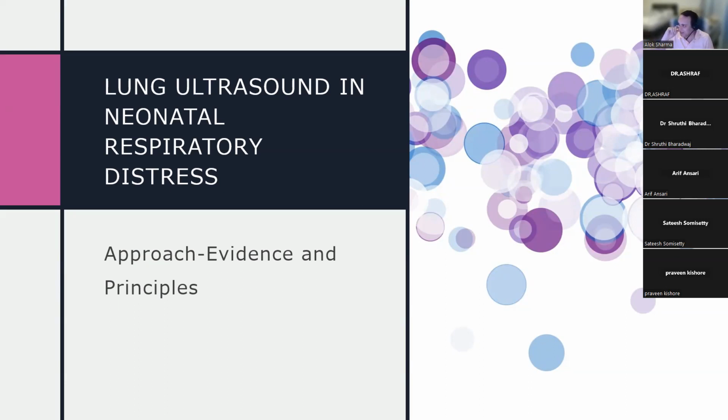And the question that I would always ask is, does that baby need to be on the ventilator if they're completely well? I have seen babies who are completely well, who are clinically stable, where I've done lung ultrasounds, and really the scores have hit 10 quite easily. And again, the question then is, are you going to treat the ultrasound or are you going to treat the baby? So I would say, the baby.